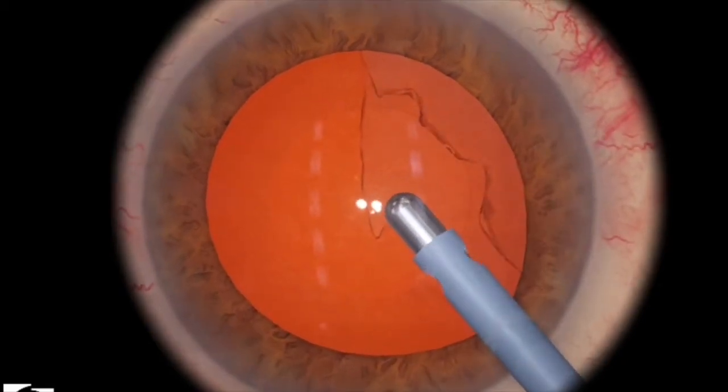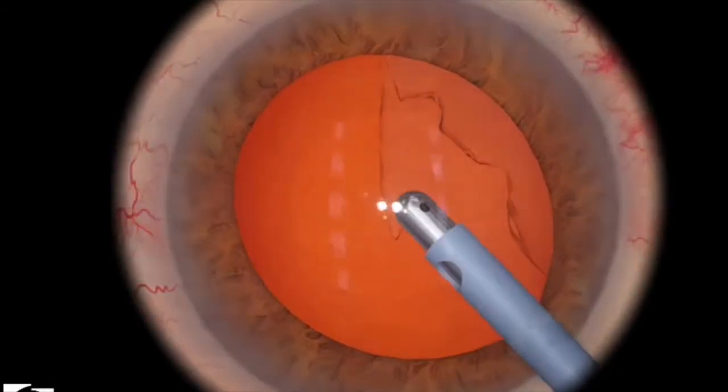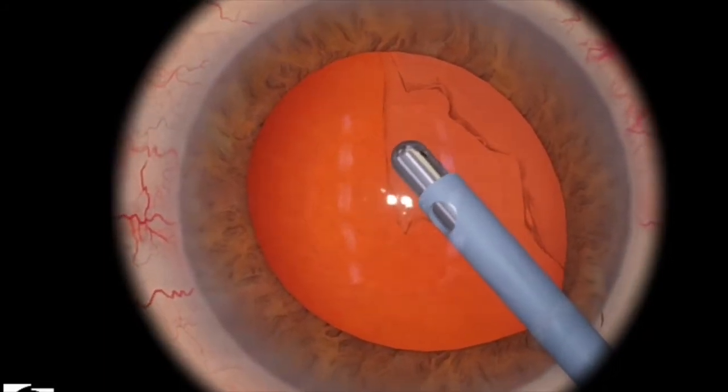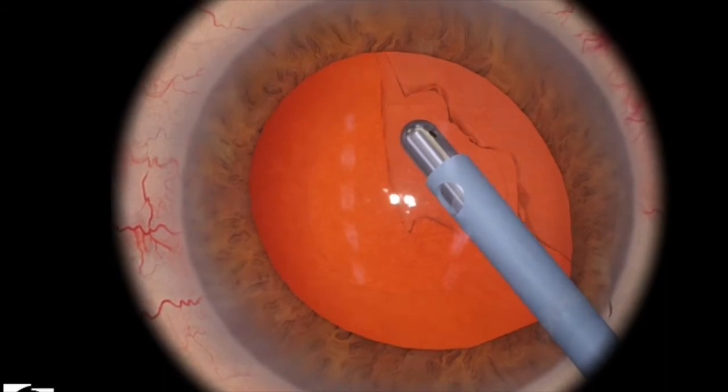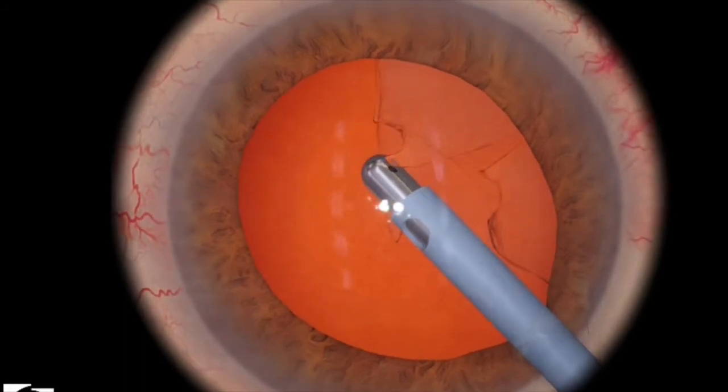Let's take a look at that one more time. This time I'm using a straight Irrigation Aspiration tip — all you have to do is just turn it a little bit. Remember the hole always has to be pointing up, not ever pointing down, because then you can rupture the posterior capsule.